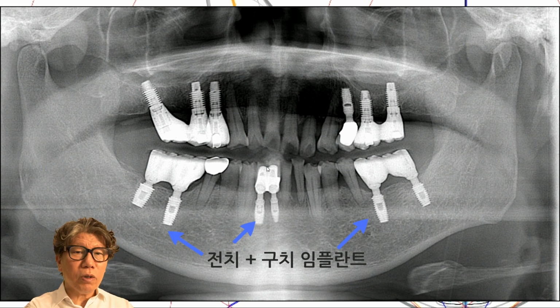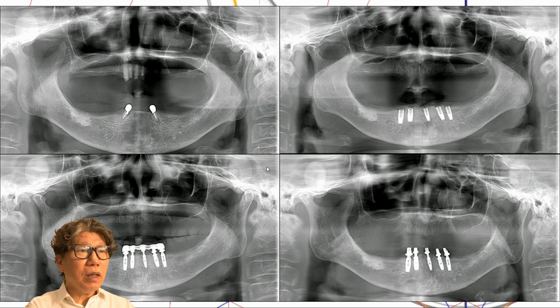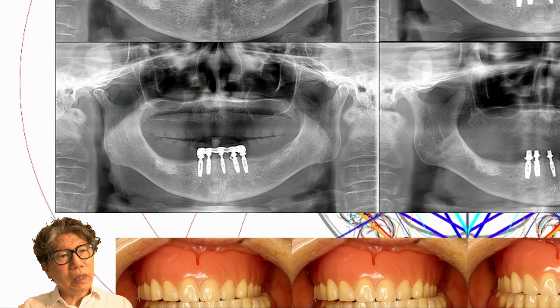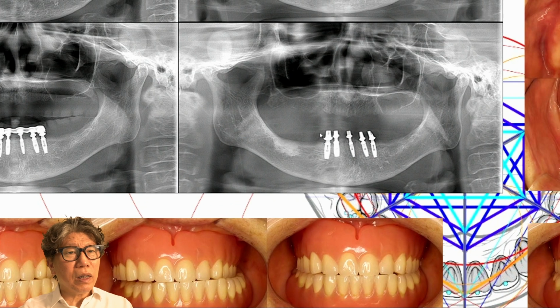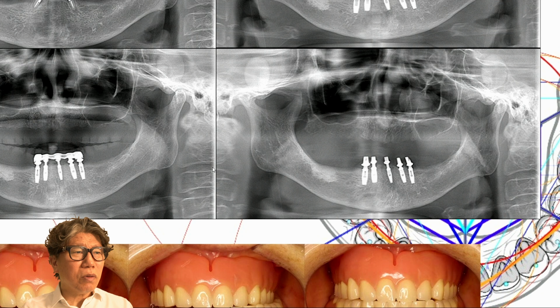So, if you do some research on this as well, you'll find that the same things are repeated. He is a bit older, so he decided to get full mouth implants on the bottom, but since he was very afraid, he only got the anterior teeth done and couldn't do the molars. Also, as you can see, he connected the abutment, did the casting, and then capped it like a conus crown. The reason for this is that if we use an attachment with rubber like an O-ring, it requires constant replacement, so I just started using the metal material, I-bar.